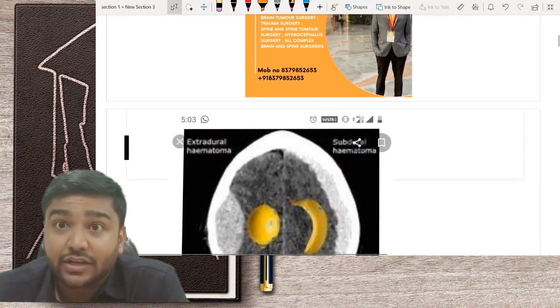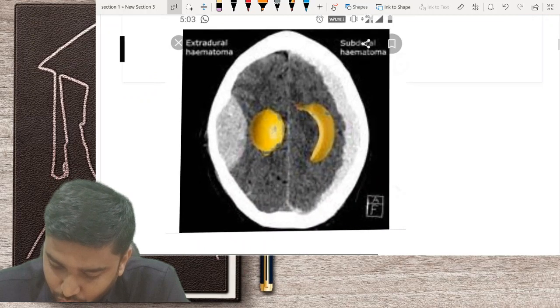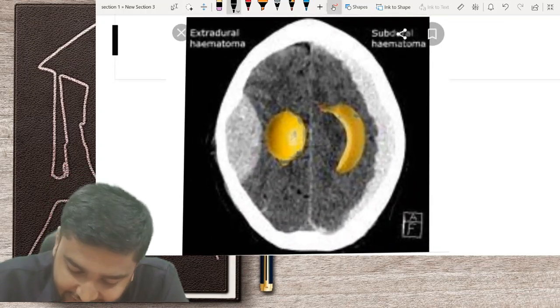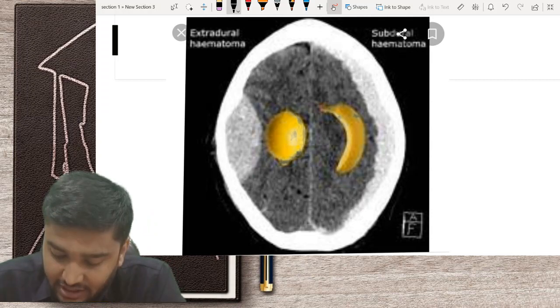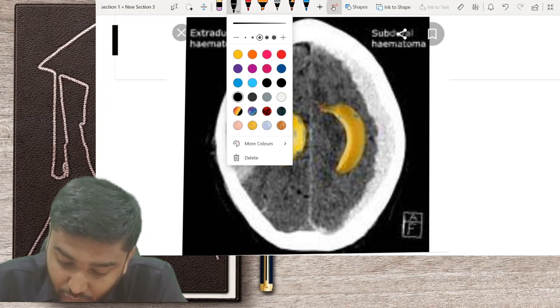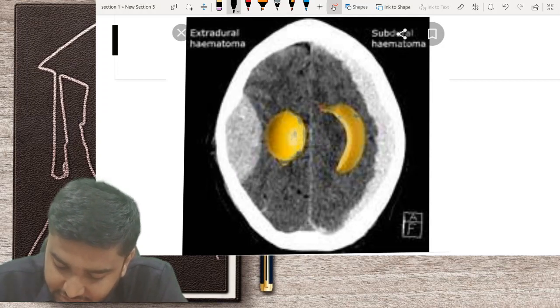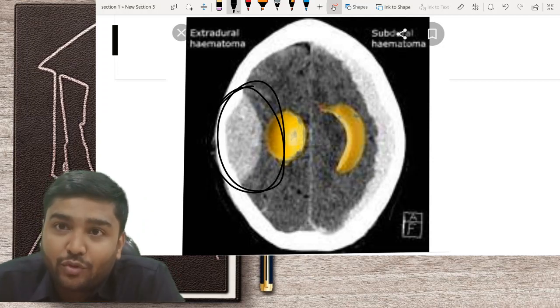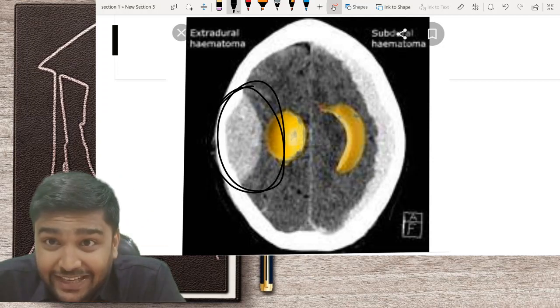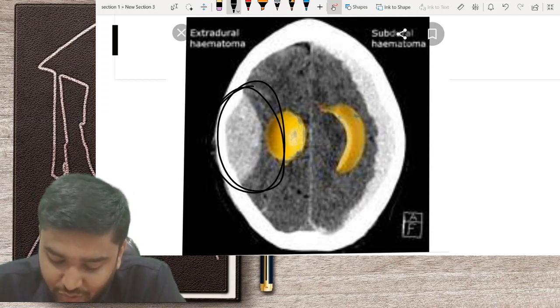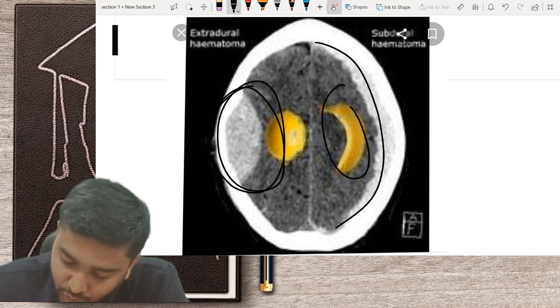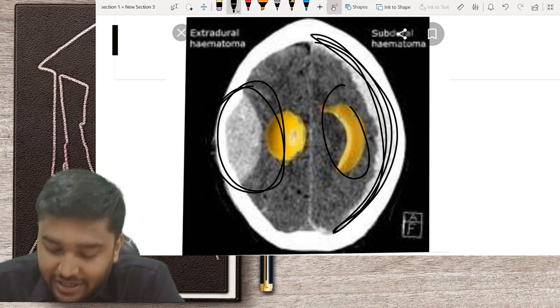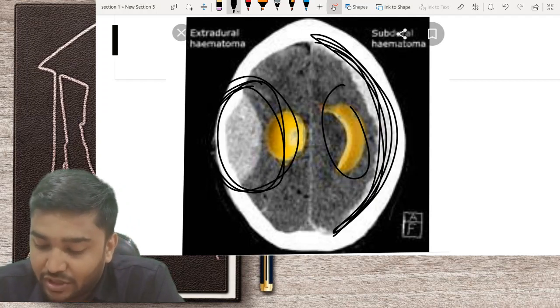Let's start with very basics. I call this the 'idli sign' — this CT scan shows a very typical bi-convex lens shape, which you can call idli. That is extradural hemorrhage. Anything which looks like a banana, going with the concavity of the skull, is subdural hemorrhage. I hope everybody understands the difference between extradural and subdural hemorrhage.